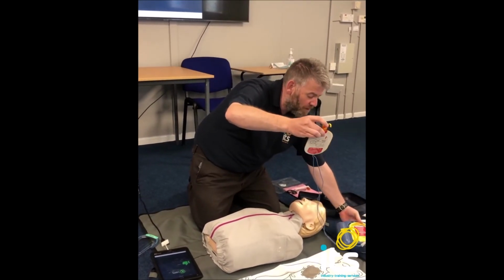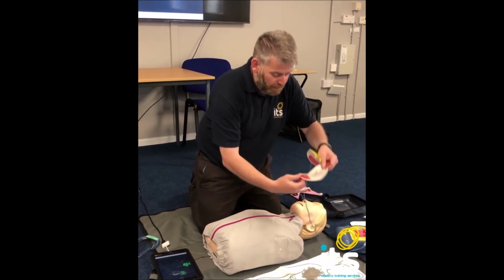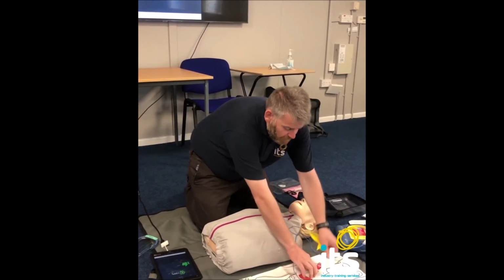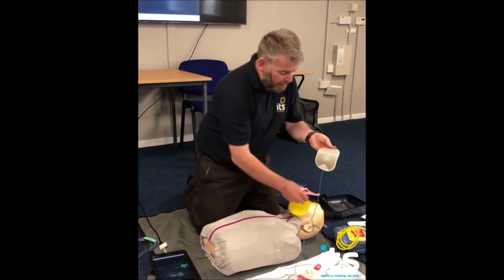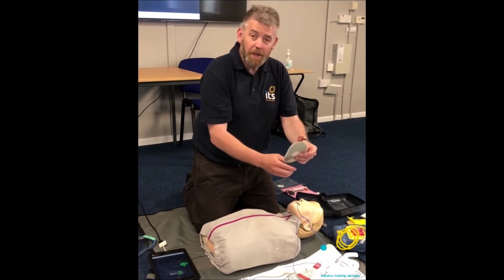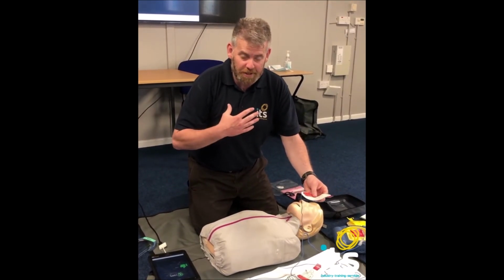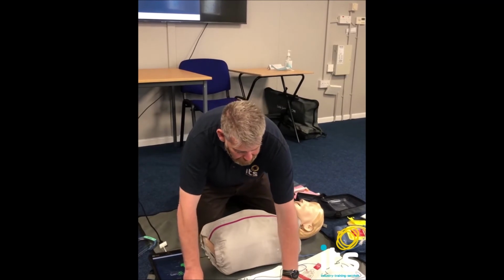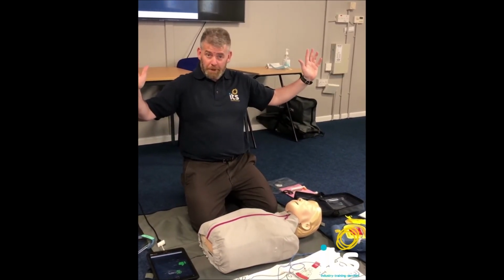That's why the machine's telling you, look carefully at the pictures on the pads. Make sure the defibrillator is on the same side as you. Take the first pad off and place it down. Place pad. Remove the liner from the second pad, and as soon as you put the pad on, the machine will start to analyse. And it's important at this point you're not touching the patient. When the first pad is in place, no one should touch the patient. Warn people to stand back.